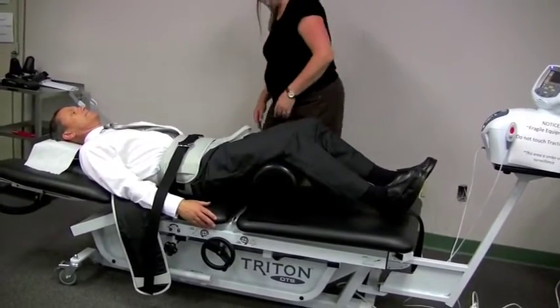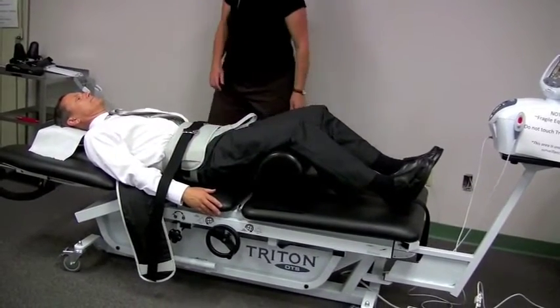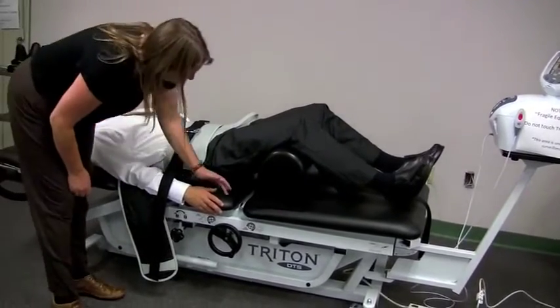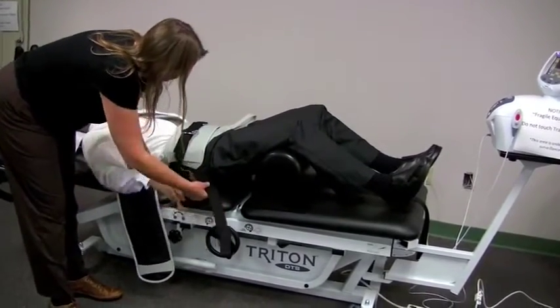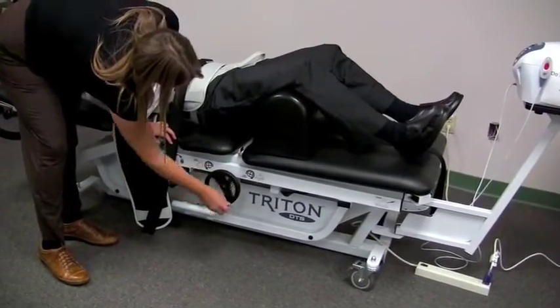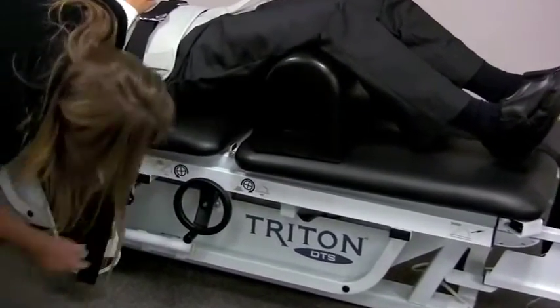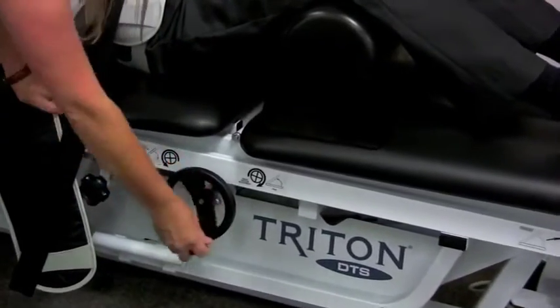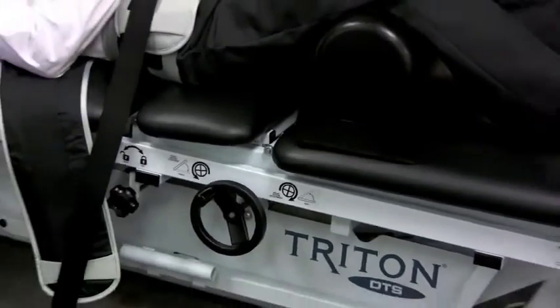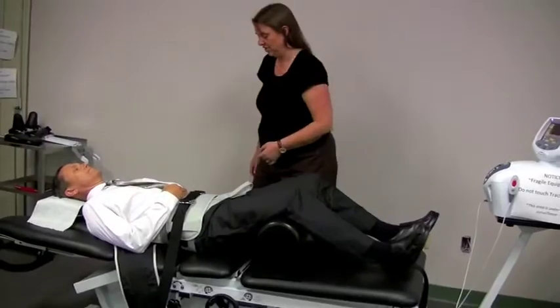Now, there is a way to change the pelvic piece here so that there can be an increased and decreased angle. And it's going to depend on your patient's comfort and your treatment goal. So let's go ahead and put your hand right here for a sec. If you can see how this can go up and can go down. So I'm going to bring this up a little bit and see how it feels to you. Do you like it better up? Sure. Some people do, some people don't. Around 6 to 10 degrees seems to be the average with our well patients who are getting the traction done.